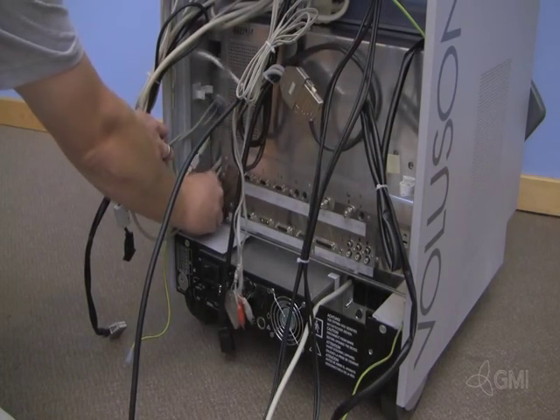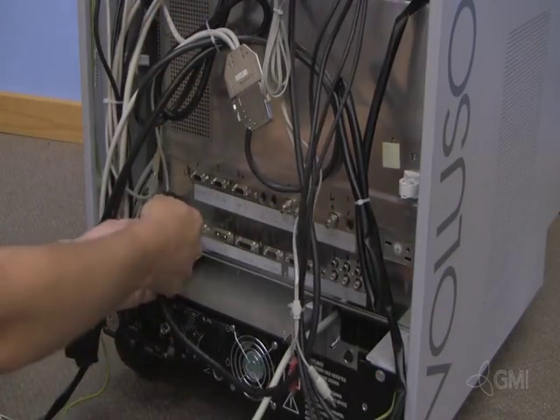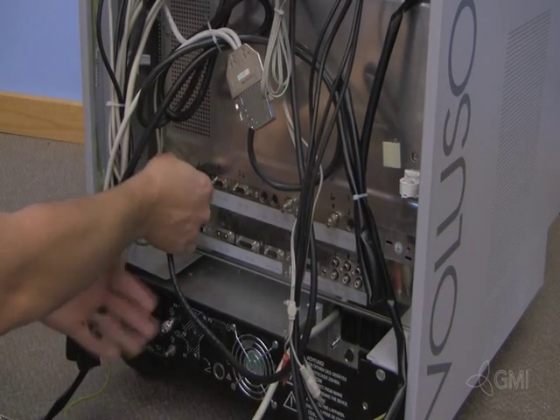Reinstall the two screws to secure the e-box to the chassis. Starting from the left, reinstall all cables to the e-box.